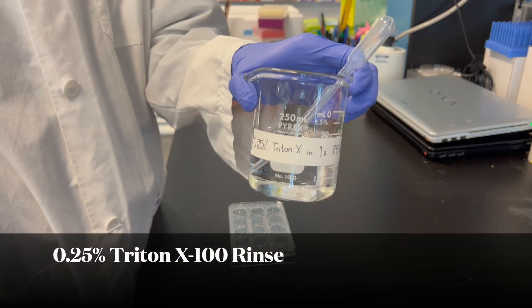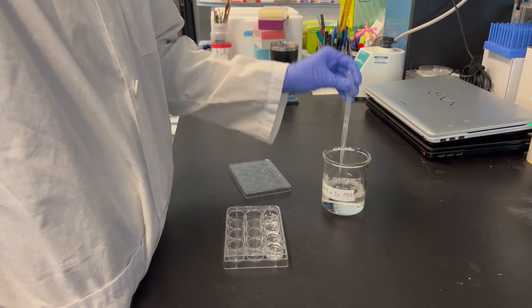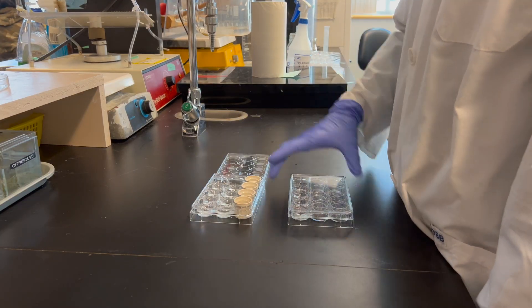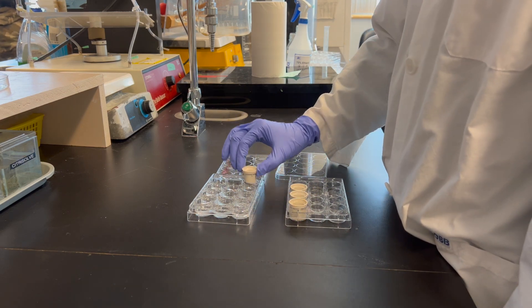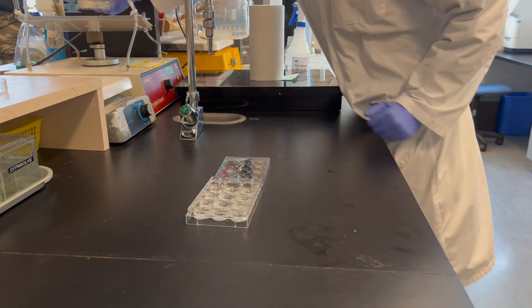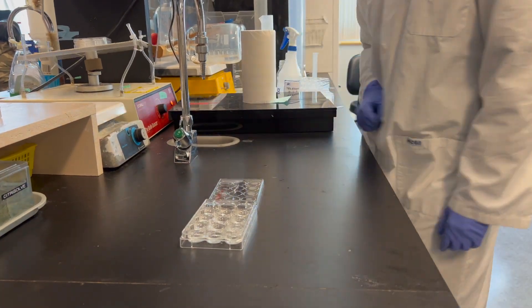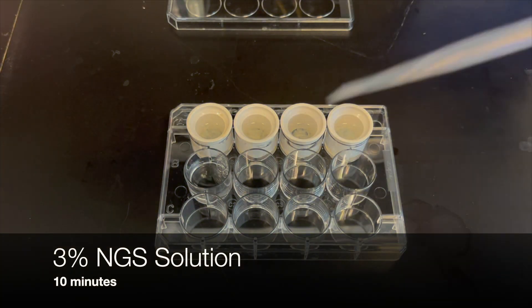Here, antibodies specific to BRDU will bind. Once the primary incubation is complete, transfer the slices into a PBS solution with 0.25% Triton X-100 for 2 washes at 10 minutes each. Triton X-100 is a detergent and is used to increase cell permeability through the solubilization of the lipid membrane. Next, transfer the slices into a 3% NGS solution for 10 minutes.